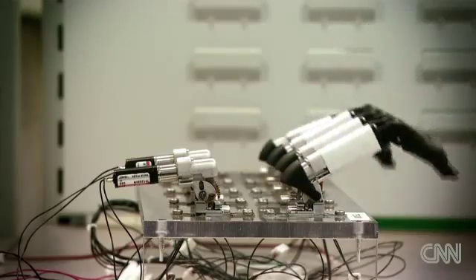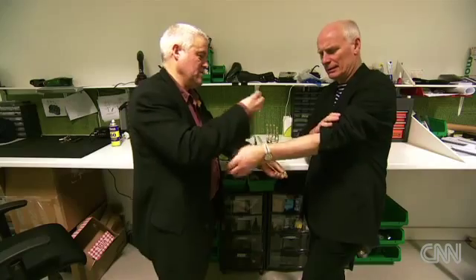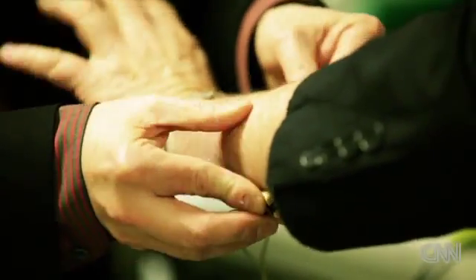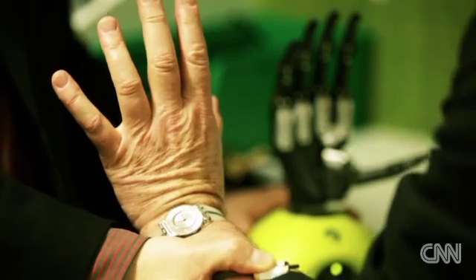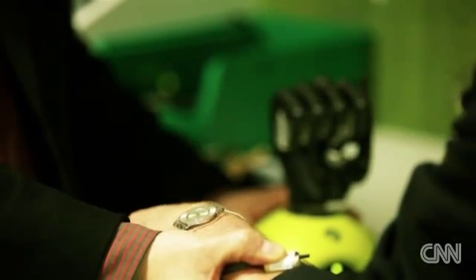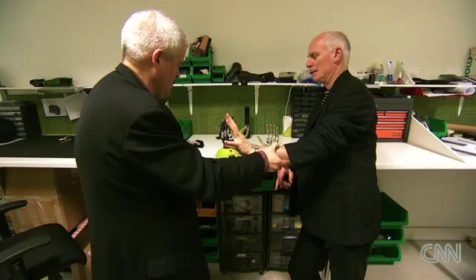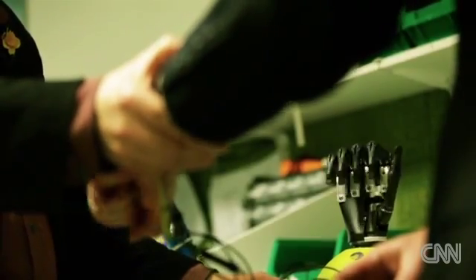How easy are they to operate? Sensors are attached to the muscles on my upper arm, just as they would be to an amputee. Just make exaggerated movements of your wrist. The key is to move through the movement so one muscle gets tight and the other relaxes. Goodness me, that's astonishing. I'm beginning to learn how to instruct it.